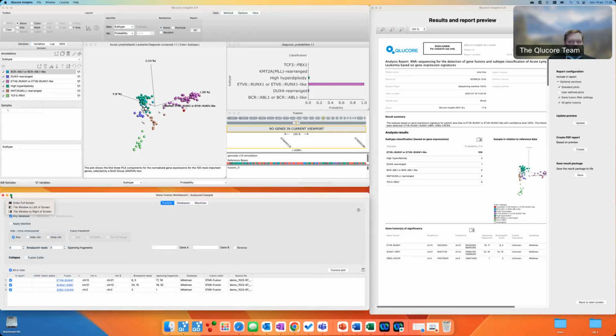We'll make that a little bit larger, like that. So there is a bit more interactivity here than in the results window. You can't do a whole lot of things there, but here you can do a little bit more. And there are several filtering options up here.